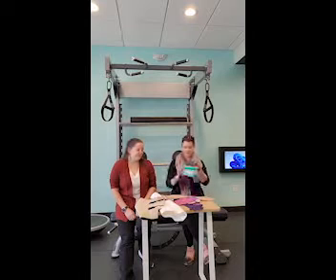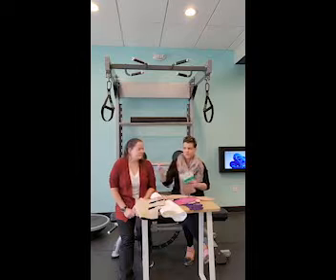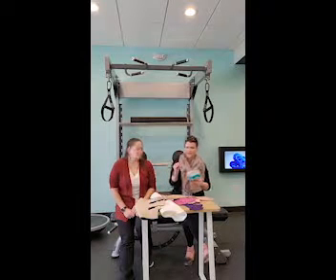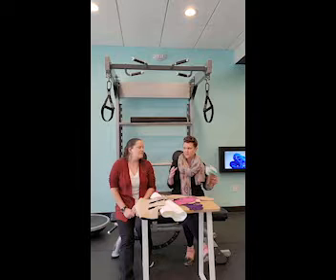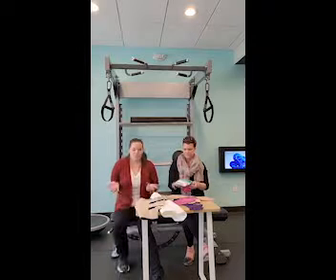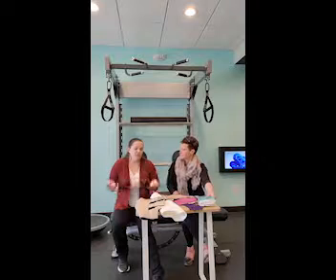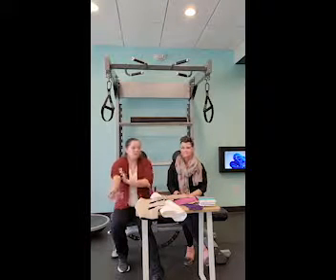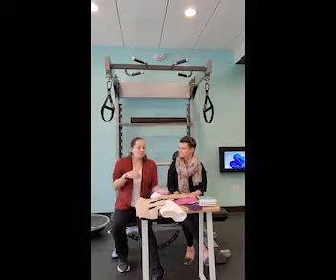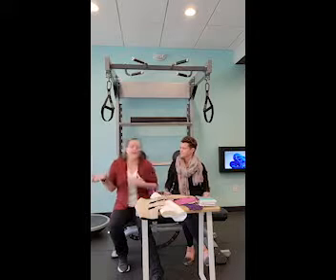Purple and pink, and these definitely have more of that containment we're talking about. So where soft has minimum containment, dynamic has more, and then your flat knits really are going to resist that propensity to swell. When I'm looking at a patient in front of me, I ask what their day-to-day looks like. Do they wake up in the morning and have absolutely no swelling, and maybe they swell a little after they work out? I'm looking at maybe the soft, potentially a dynamic, depending on where they're at.